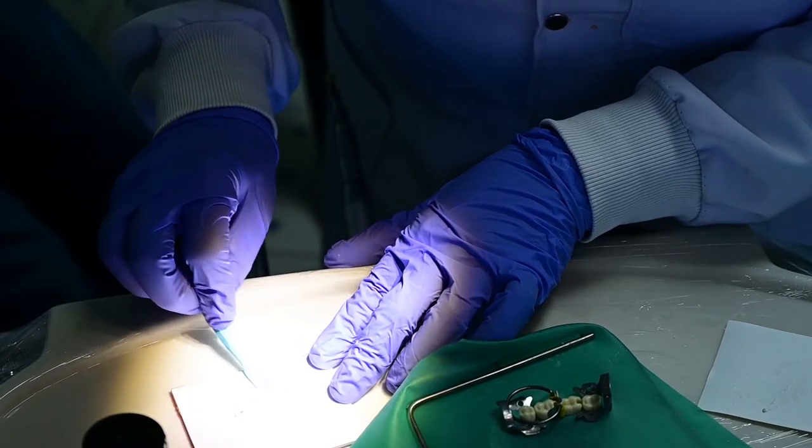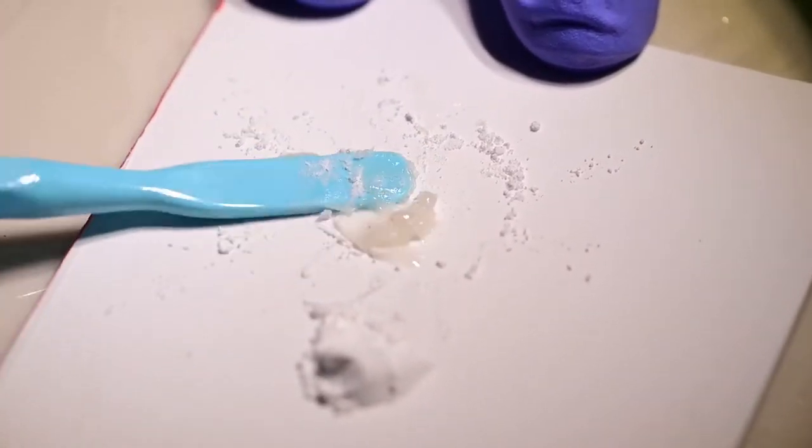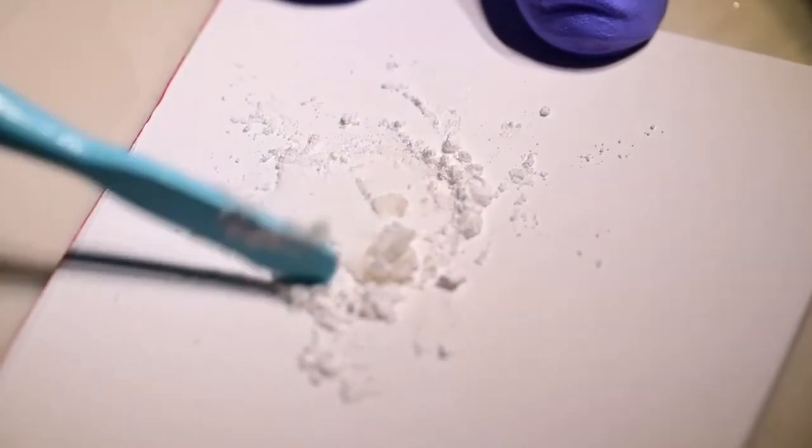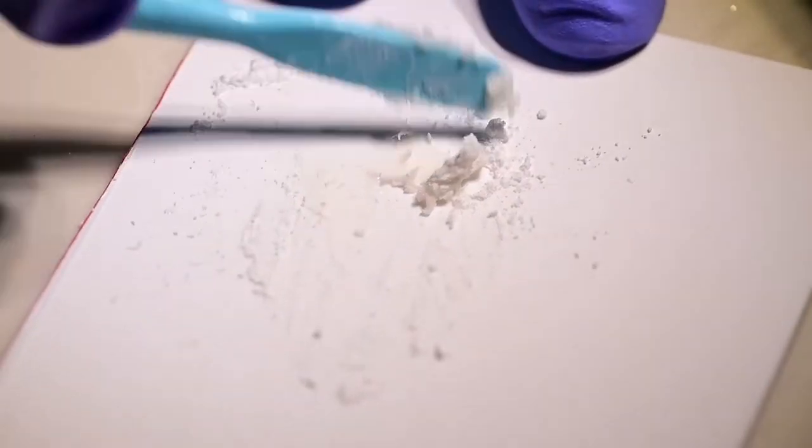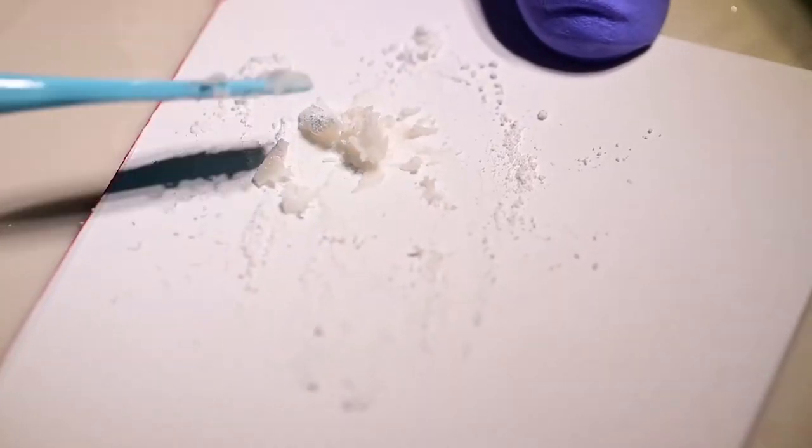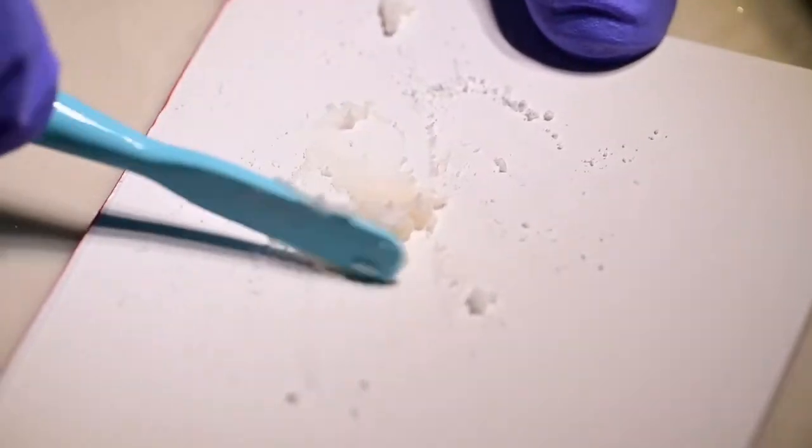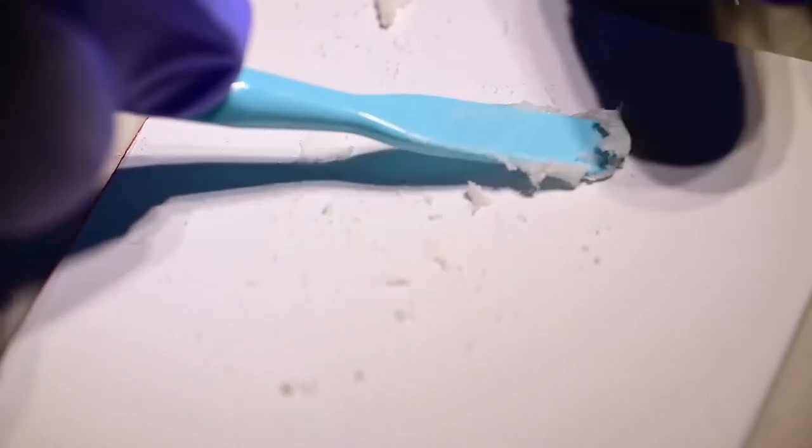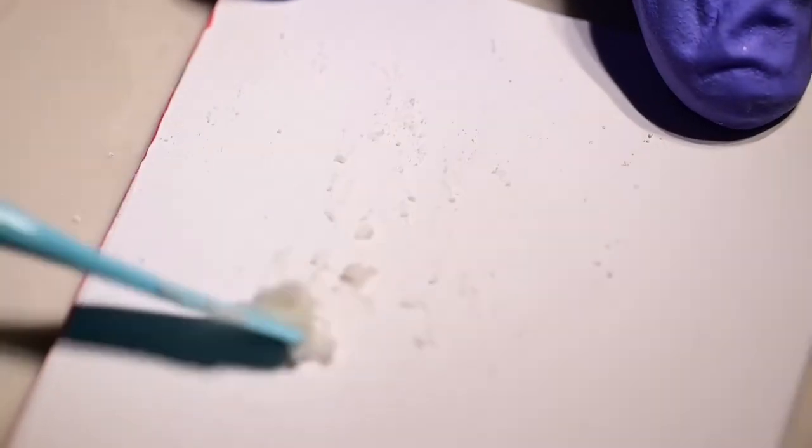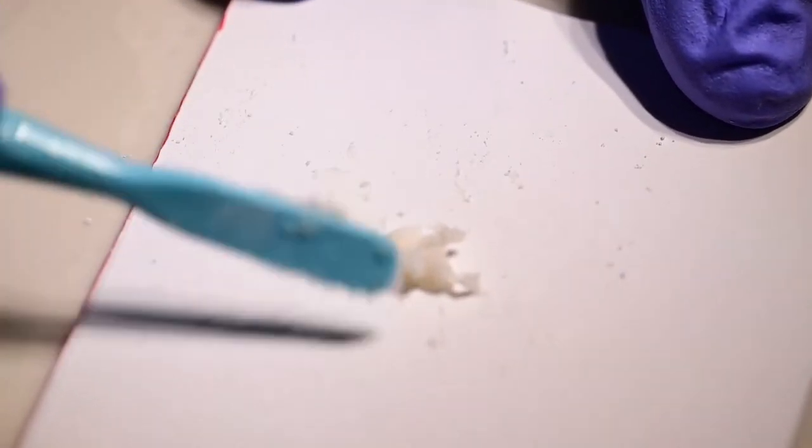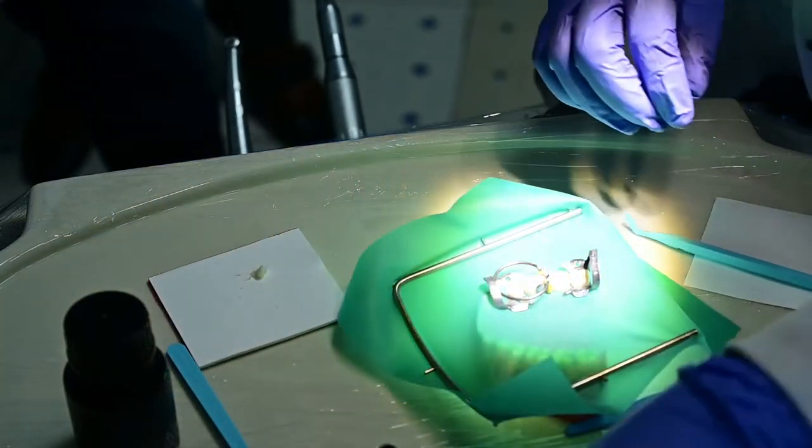You should mix it into the powder in 45 seconds. And again it is good to use an agate spatula if you have one. So I will do it in two increments. Cention is a good alternative to dental amalgam but you can only apply it on moderate sized cavities. Of course literature has a lot of indications for it but it is also good to wait for long term clinical trials for these materials. So I am about to get to the 45 seconds I believe. It is actually a packable material. So once I am done with the incorporation of this powder I will be placing it in the cavity which is isolated the same way we isolated with the resin composite. Now I am ready to pack the material.